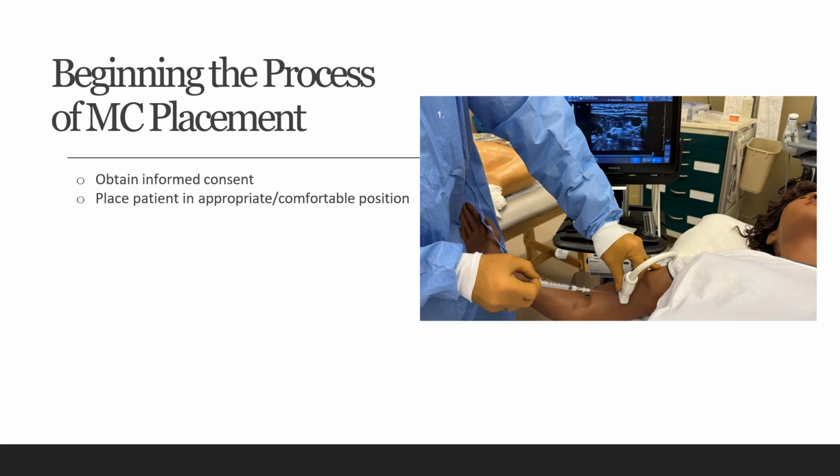This could vary from center to center, so just check with your administrators. A lot of times we put in catheters, and our nurses do as well, without getting that, but this should be a sterile procedure. You're having to do a lot of work for it. They may actually require that to be done, but again, just check, make sure you're not getting on the wrong side of anyone. But we would get that from the patient or the surrogate.